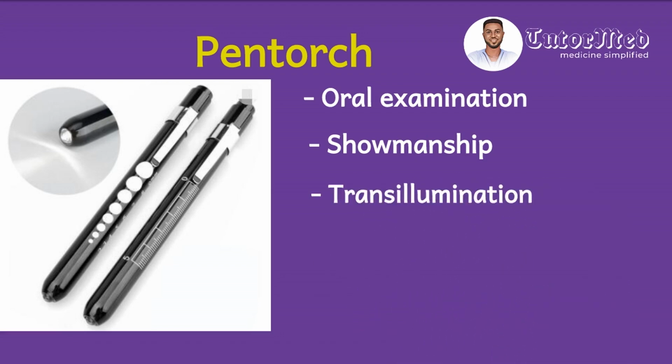And the third is usually in surgery for transillumination of superficial swellings. You put the pen torch on the side of a superficial swelling, and then you look whether the light is transilluminated through the superficial swelling. If that occurs, then most likely the swelling is fluid containing.